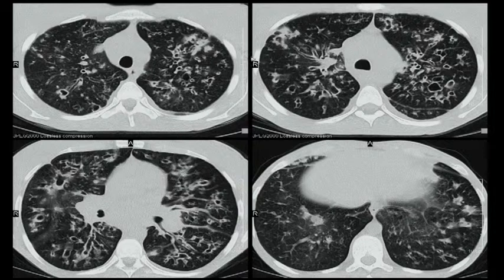Again, let's look at this one. There's a dilated bronchiole with a pulmonary artery. So this is not just any cyst. I may not show you branching. I may not show you the origin of it coming from the main bronchus then into the first order, second order, third order branches. All I'm going to show you is this, and you have to look at it and say the signet ring sign is positive. This is actually a bronchiole. Does that make sense? Yeah. Other cysts, for example in bullous emphysema, where do you see the adjacent pulmonary artery next to them? Never, because they have nothing to do with the bronchial tree per se. They have to do with small airways disease.